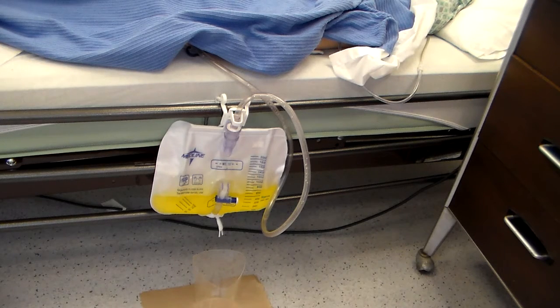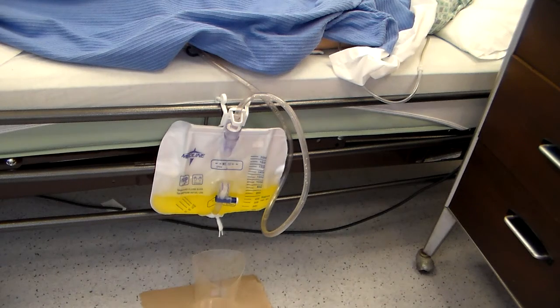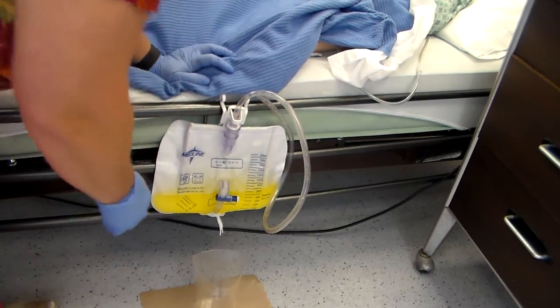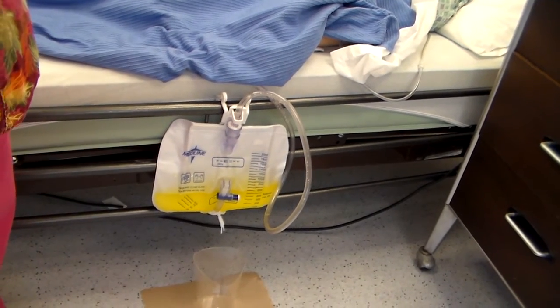You're going to get your alcohol pad ready to go because you don't want to be fumbling with trying to open the alcohol pad when you have the dirty tube in your hand from emptying the catheter. Let me try the other side, see if it will be better. Okay, so we have our alcohol pad ready. Now what we want to do is take this tube out from the bag itself.